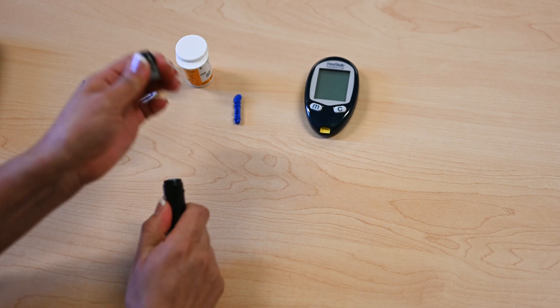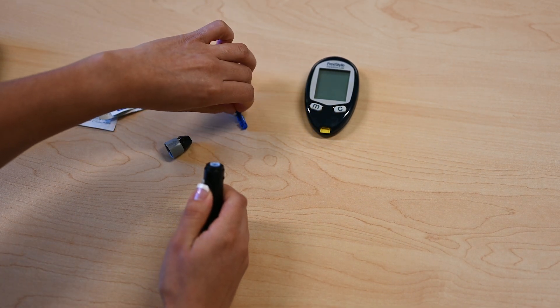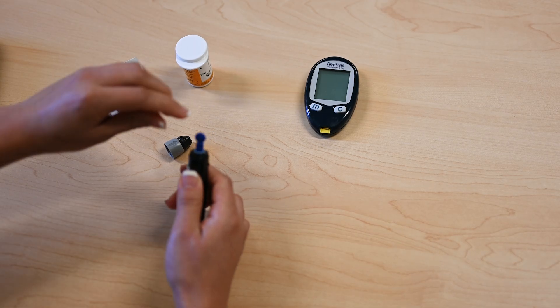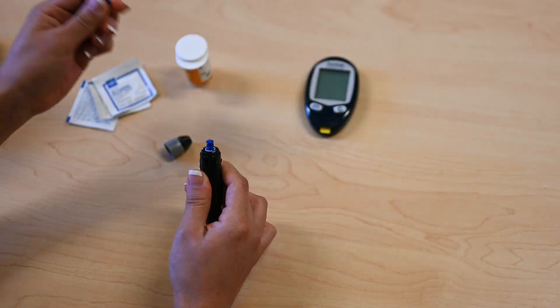Remove the cap, insert a lancet, twist off the needle cover, and then replace the cap.